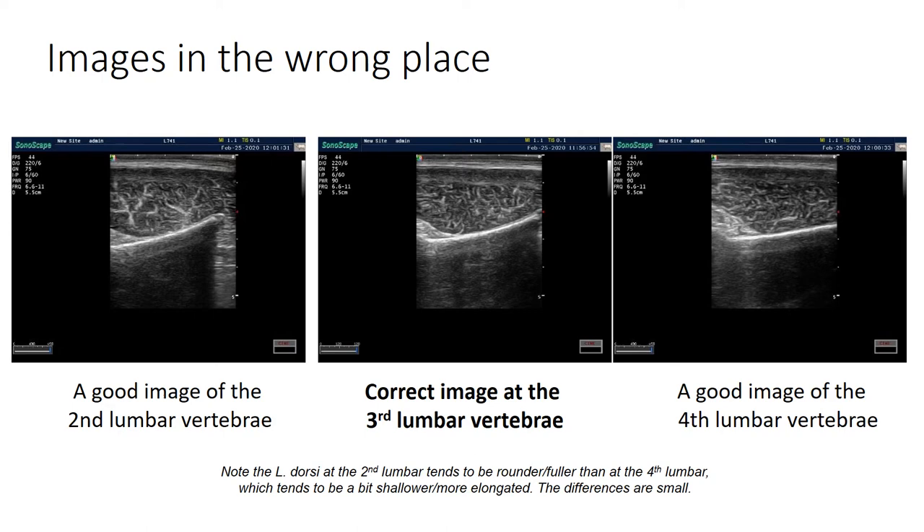Here are a couple of images showing the challenge of scanning on the wrong vertebrae. All three are nice images, and it shows it's actually quite hard just from the images to tell if you're in the wrong place. The second lumbar tends to be a little rounder and fuller; by the fourth lumbar it tends to be a bit shallower and more elongated - but the differences are relatively small. So it's important to keep feeling where you're measuring on the sheep and making sure you stay on the third lumbar vertebrae.